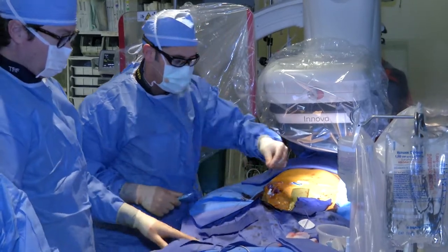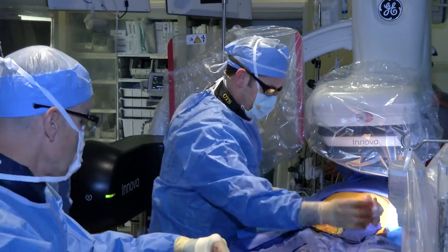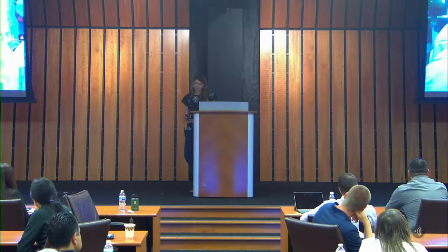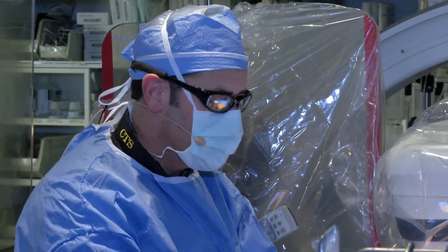Regarding the clocking, you mentioned it was 11 o'clock and 1 o'clock. Yes. Is that your standard practice, or does that vary from patient to patient? Is that always 11 or 1? That's typically what I do, and you'll see that other operators do things differently. Some people like to just deploy both of them at 12 o'clock. The issue is that if you deploy them both at 12 o'clock, sometimes you'll get an incomplete closure.